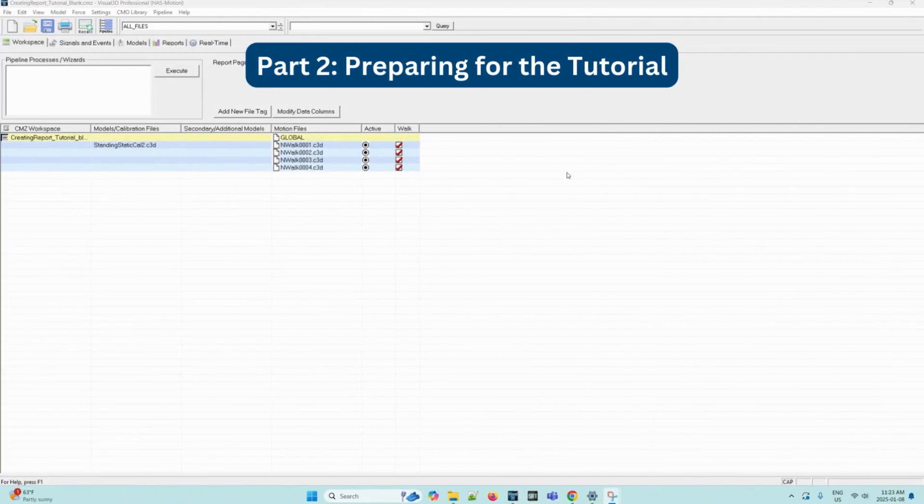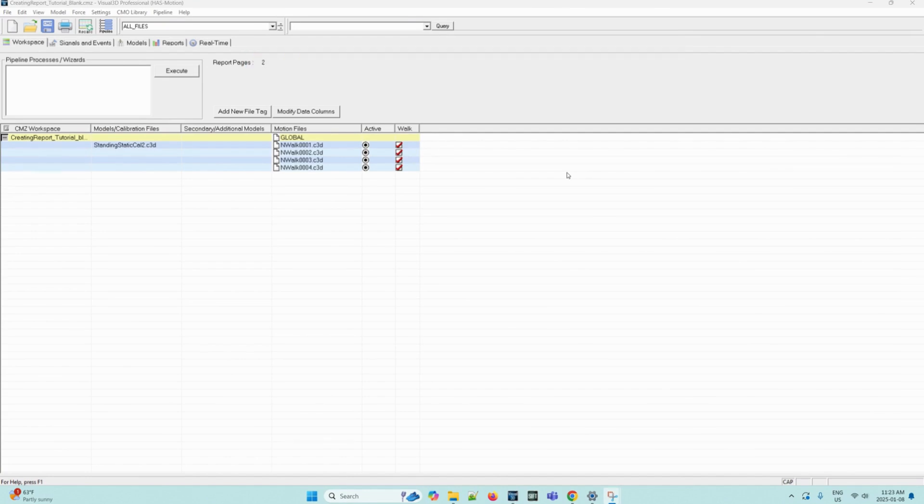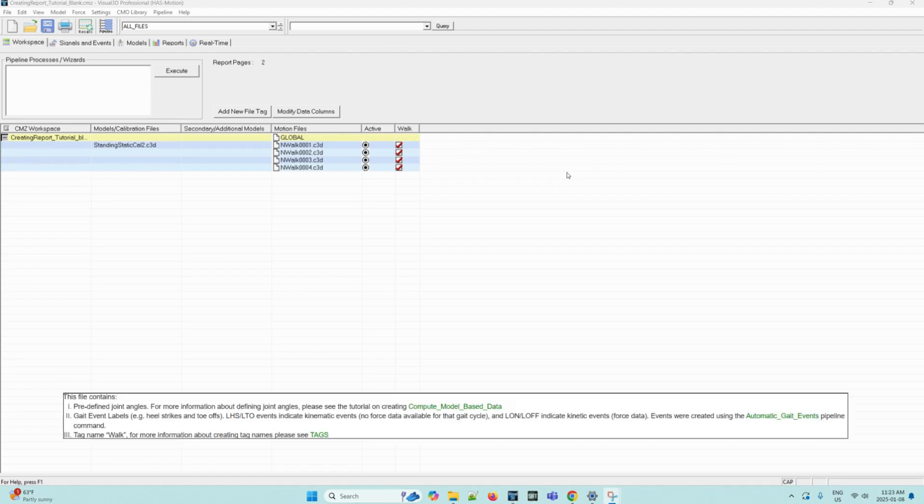If you have not already done so, download the CMZ file for this tutorial off of the wiki page and open it on the application. This file contains, number 1, predefined joint angles. For more information about defining joint angles, please see the tutorial on creating compute model-based data.